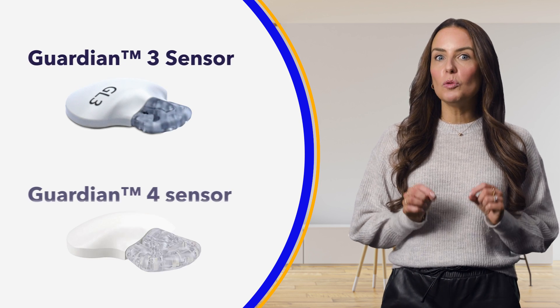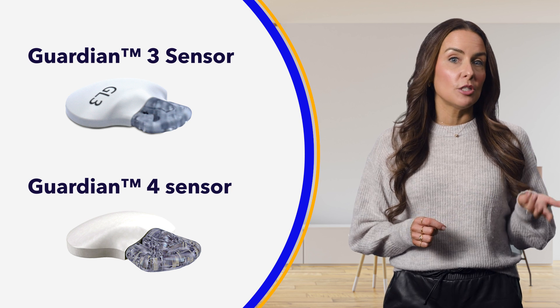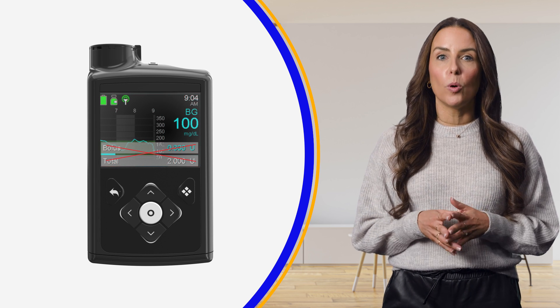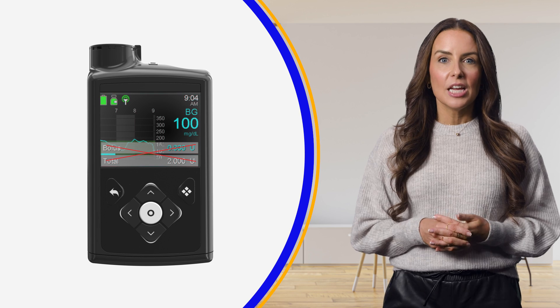Second, you must be wearing the Guardian Sensor 3 or the Guardian 4 sensor. Next, you'll need to confirm you don't have any active temp basal or bolus being delivered. You can check this on your pump's home screen.